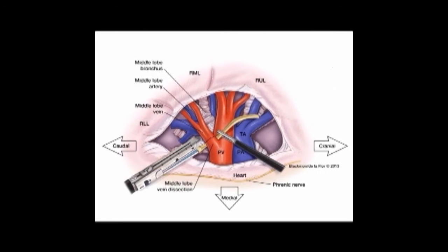For a thoracoscopic right middle lobectomy, the approach is slightly different than that for a right upper lobe or right lower lobe. The structures are similar from the back and you should perform the posterior dissection of the pleura first. Once that has been performed, you can then approach from the anterior aspect of the hilum. By dividing the pleura and taking care to preserve the phrenic nerve, you can encircle and dissect the pulmonary vein. Make sure that you do not have a common vein and that you have only the superior pulmonary vein, encircling, stapling, and dividing only the right middle lobe branches of the pulmonary vein, specifically preserving those branches going to the right upper lobe.